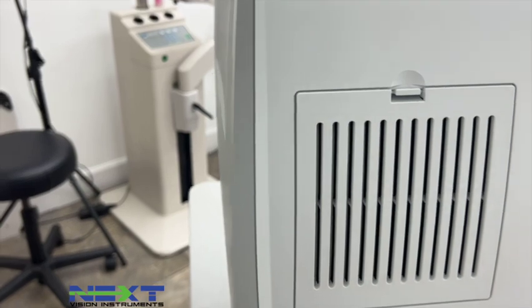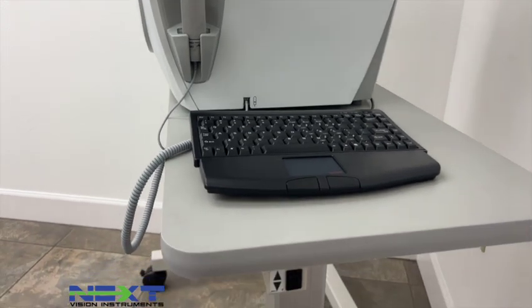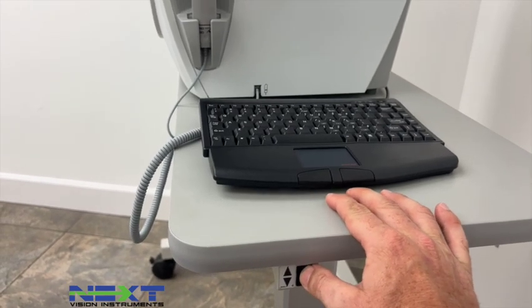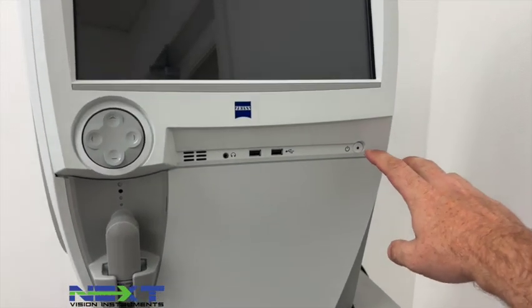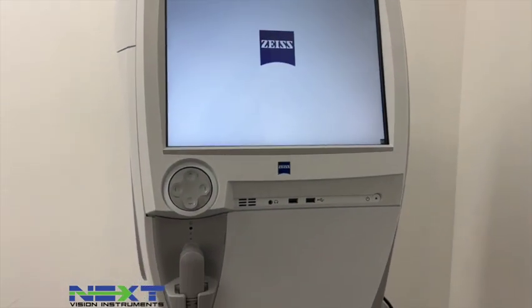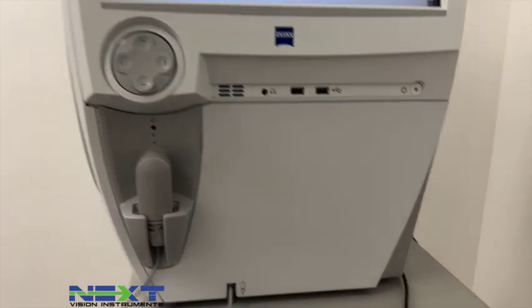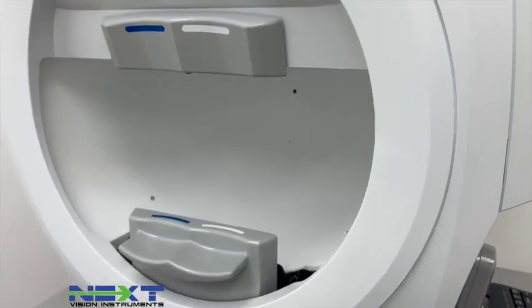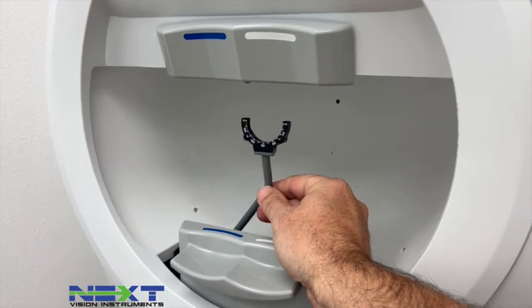Once everything is connected and plugged in, your table should have power up and down. If the unit is connected to the table you should be able to push this button to fire the unit up. On the front you also have a couple of USB ports where you can plug the keyboard in as well.